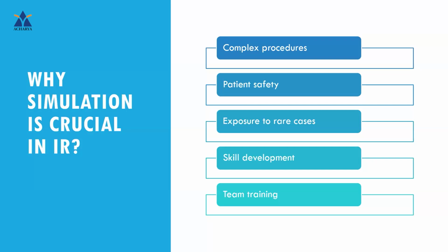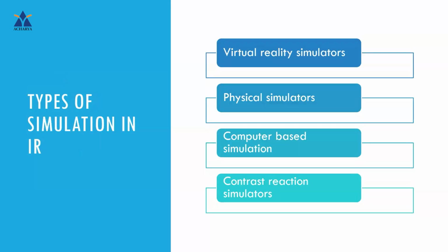So usually your interventional radiology procedures will involve multidisciplinary teams. Simulation will allow for team-based training so that you can improve communication, coordination, and teamwork among radiologists, nurses, and technologists. Now we'll see the different types of simulation that can be used in interventional radiology.